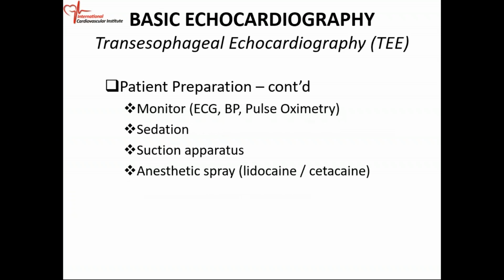Again, you have to have functioning monitors: ECG monitor, blood pressure monitor, pulse oximetry, because sometimes the patient might be getting into trouble. It might be hypoventilating, and the O2 saturation might be 60%.